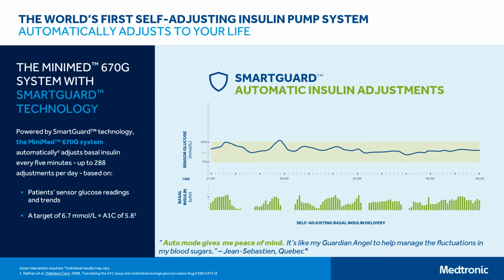The pump's algorithm makes a decision to deliver you a micro dose of insulin to replace what you would have set in your basal rates if you are using a pump, or your long-acting insulin injection if you are using injectable pens. It does this 288 times a day, which is 24 hours broken up into 5-minute intervals. The pump and CGM basically manages your basal or fasting blood sugars for you, letting you get on with your day. What you still need to do is bolus for meals.